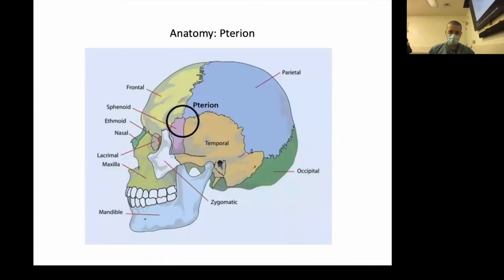So to start, let's start with anatomy. And probably the most important anatomical structure for beginning transcranial Doppler is this confluence of bones on the lateral sides of the head, and that's called the pterion, where the parietal, frontal, and temporal bones all come together. And that's an important structure because that is the thinnest part of the skull and makes for insonation of underlying parenchyma, vessels, etc. Okay, so lateral temporal bone, pterion. That's the first structure you must know to be able to do TCD.